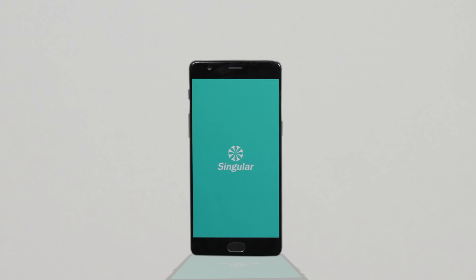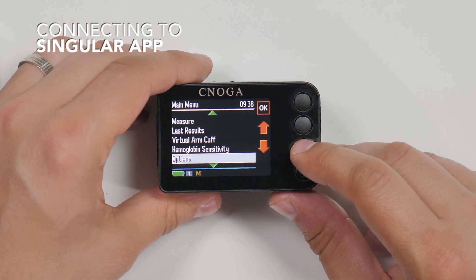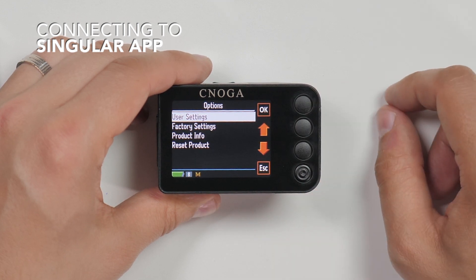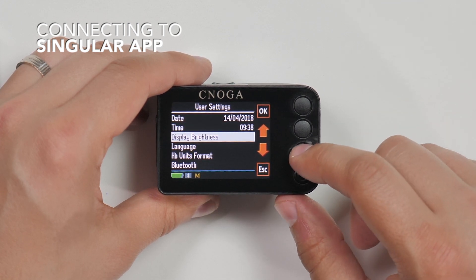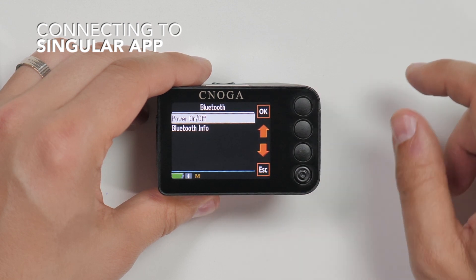To connect to the Singular app, you need to pair your device to the Bluetooth on your cell phone. Download the Singular app and register. To turn on Bluetooth on your device, choose options on the main menu, then press user settings. Scroll down to Bluetooth and choose power on/off.